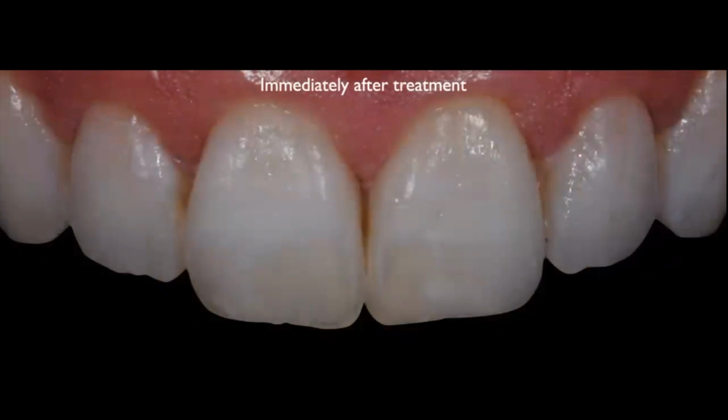This is immediately after Dr. Dean went ahead and did, I think, 4 or 5 passes of the slurry of hydrochloric acid, which is what is contained within the Opalustre product. So once you do that, you can see that he did multiple passes. Again, slight, light pressure, circumferential rubbing of the material around the tooth. You want to go up to the middle third, gingival third, and again down to the incisal third. You don't want to stay in one spot constantly, because you're going to create a depression there. You want to make sure that you get even removal of the enamel.